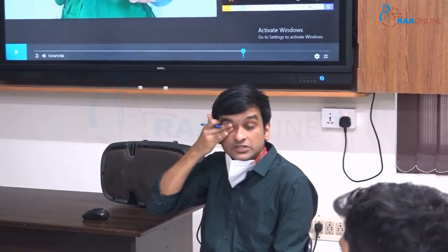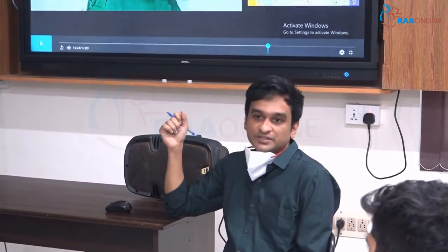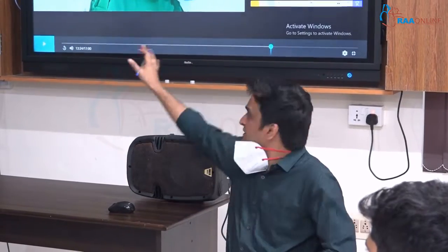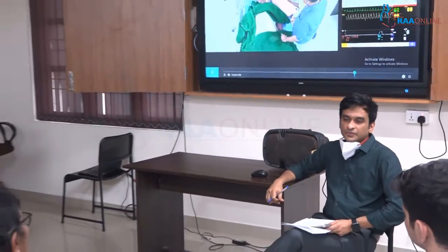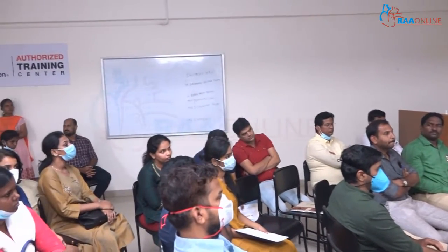So what do you think are the options when in the first scopy we are not able to visualize the glottis? I think we have had a long session on how to go about it, so let's put it into perspective. So this is the scenario. The next attempt can be with either a different size blade or a different blade, like a McCoy blade. Would you like to still persist with the scope and change the blade, or is this how we go about it? I would have liked to probably go back to mask ventilation. Is that okay?